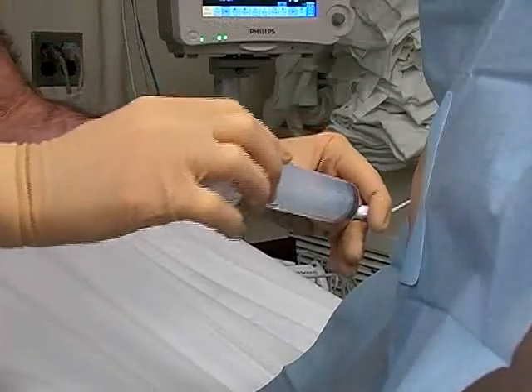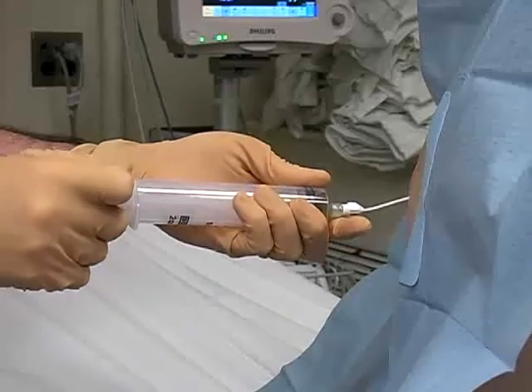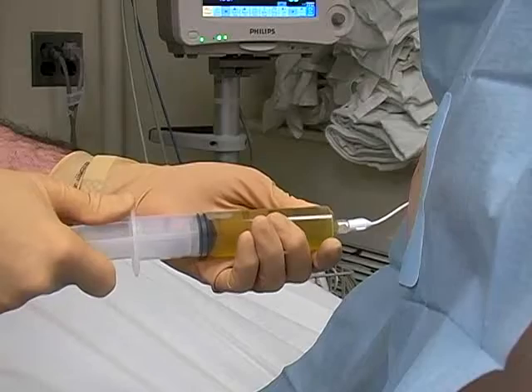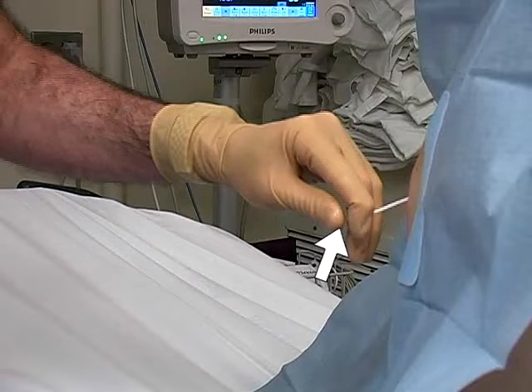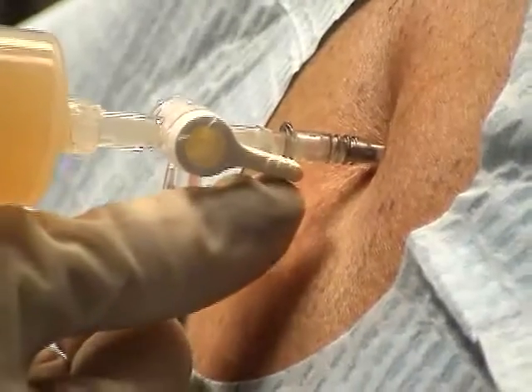Attach a large syringe to the catheter hub or stopcock and withdraw 30 to 60 milliliters of fluid for diagnostic evaluation. Once fluid collection is complete, remove the syringe and re-occlude the catheter hub with your thumb or by closing the stopcock to the patient.